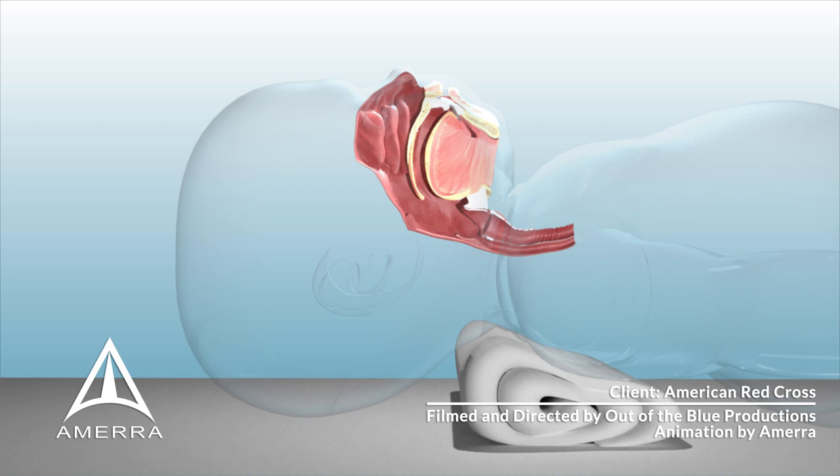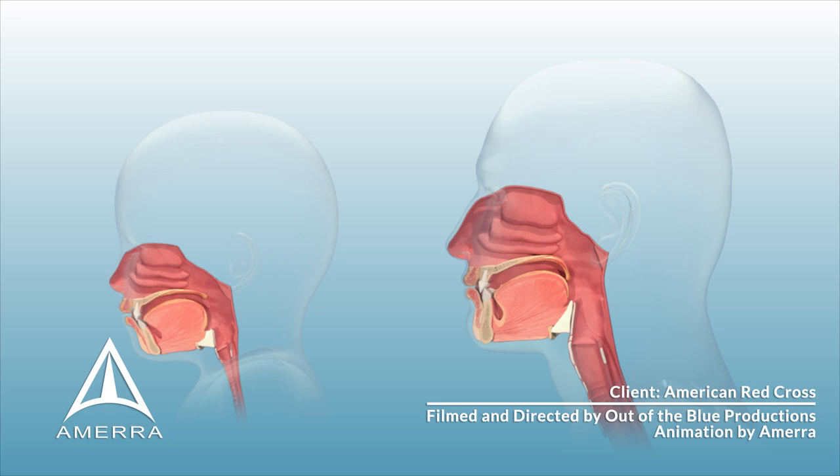In small infants, use a rolled towel or a folded diaper under their shoulders to raise the chest relative to the head. The tongue occupies a greater proportion of the oral cavity in children than in adults. This may require an oral or nasal airway adjunct to alleviate obstruction.